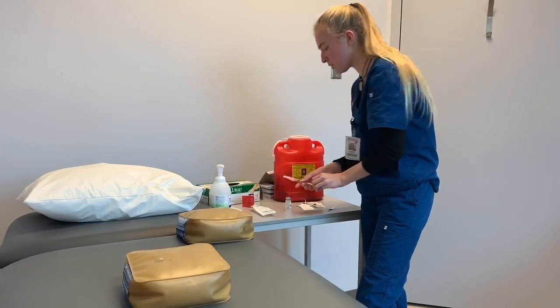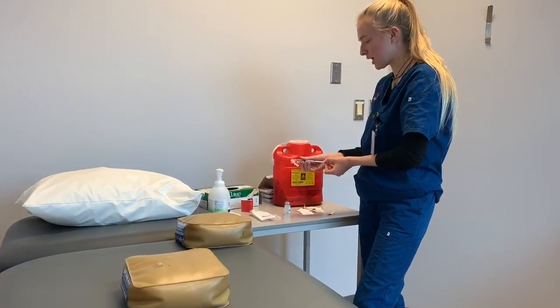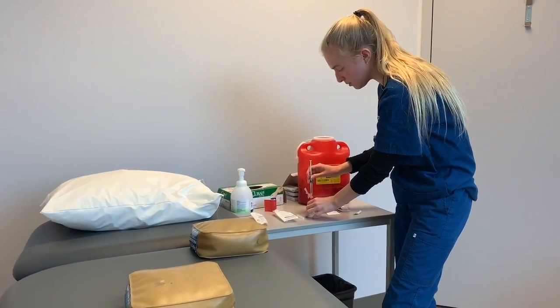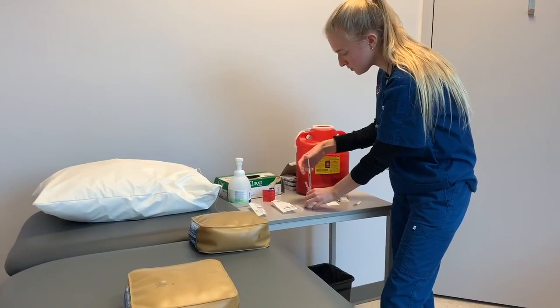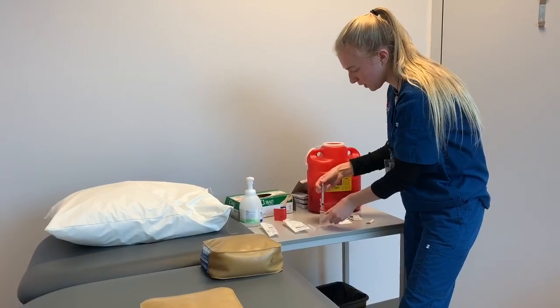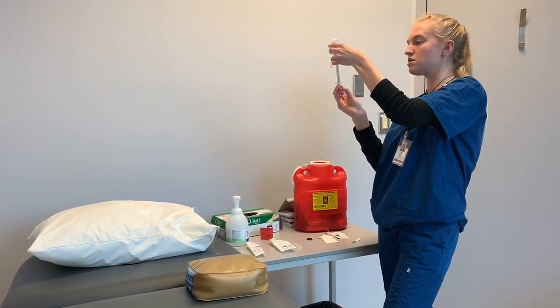Okay. I'm going to take the cap off of my needle. Again, I'm going to inject air in first to reduce the amount of air bubbles. Now I'm going to draw up 0.5 milliliters of the Haldol.